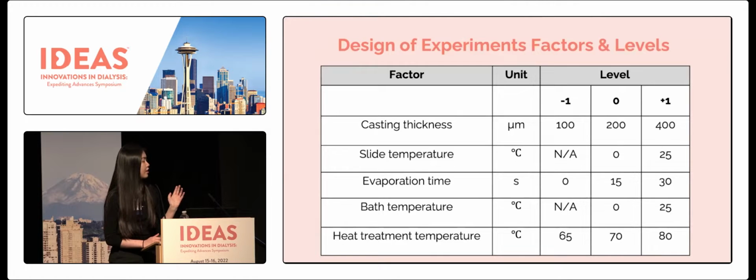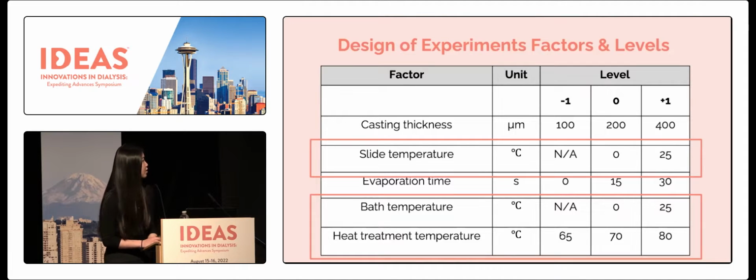Here is a design of experiment table with factors and levels. And these are just some of the things that we tested. I'll be focusing mostly on slide temperature. The slide temperature just refers to the solid support that the membrane is cast onto. And I'll also be talking about the bath temperature and the heat treatment temperature.